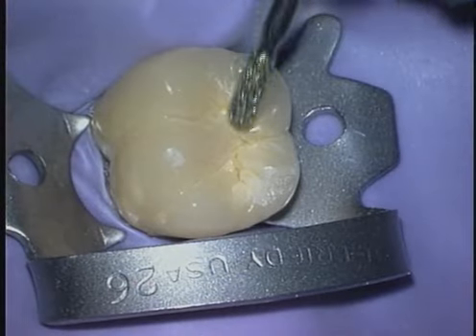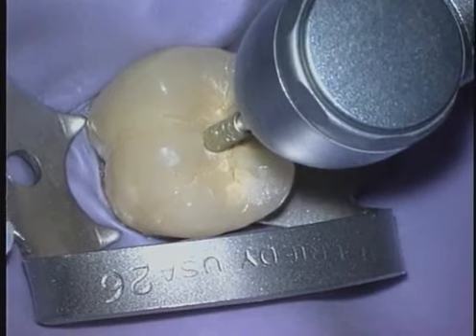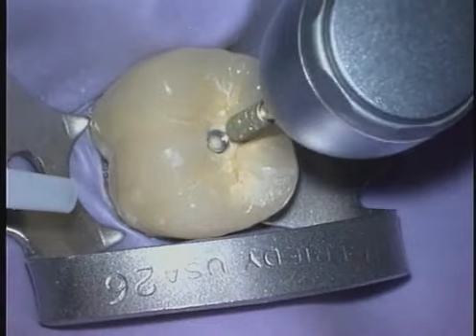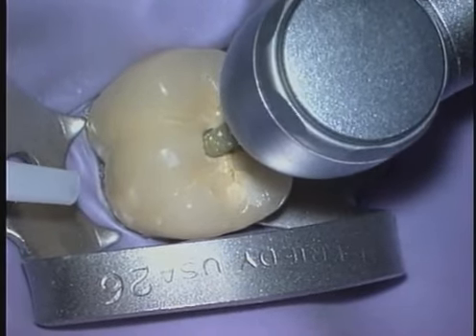Now we're going to remove a porcelain crown with the metal lift system. The self-contained kit provides all the rotary cutting tools you will need for this procedure. The diamond burr is used to penetrate the porcelain layer until the underlying metal is observed.